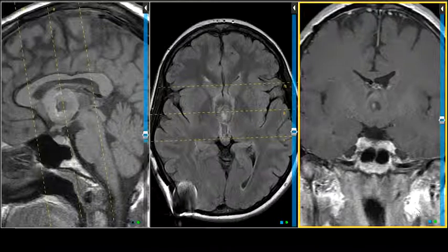We've got macroadenoma, it's not. Meningioma, it's not. Saccular aneurysm, wrong signal. No pulsation mismapping, it's not. Pilocytic astrocytoma, that's a possibility. Could it be coming from the hypothalamic region? Although there is a plane of separation right here, and this solid mass in the suprasellar region, cranio, the fifth one of the big five, is likely.